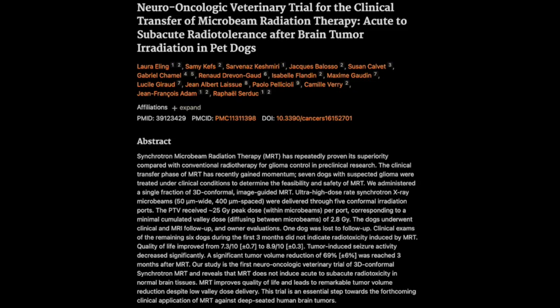Absolutely. This detailed mapping and contouring process is crucial. It allows them to deliver the highest dose of radiation to the tumor while minimizing the dose to surrounding healthy tissue, especially those sensitive organs at risk. So it's like a delicate dance between advanced technology and biological vulnerability. It truly is, and it requires sophisticated software and expertise to ensure the radiation is delivered accurately and safely.